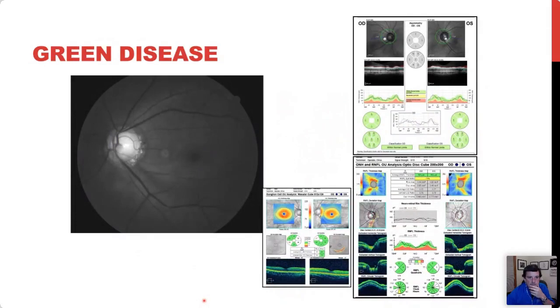And yet another example of a person who clearly has glaucoma, with an inferior temporal defect in the left eye. And we take a look at it on the Cirrus in the lower right. The thickness map maybe shows me a little something, but it really doesn't show anything statistically abnormal. The ganglion cell complex on the Cirrus also is coming within the normative database. And when I use a Spectralis, that area still is falling within the normative database. So here's a person where everything is green, we think is good, but when we look at the patient clinically, we see that they are not good.